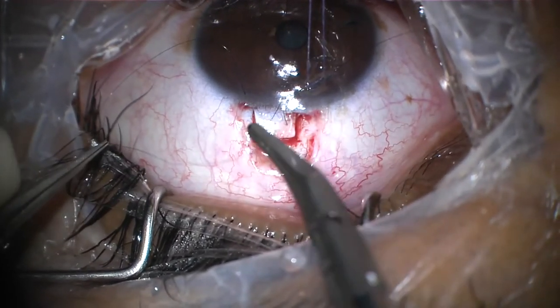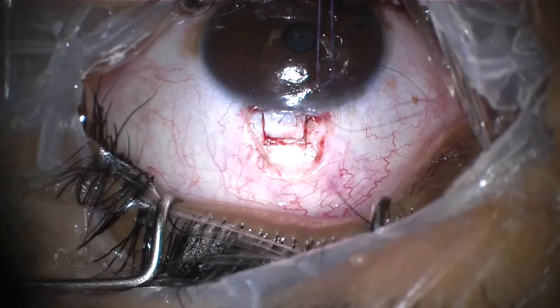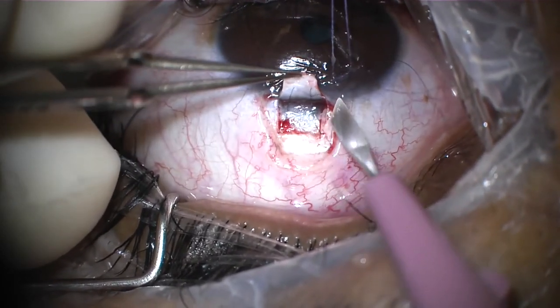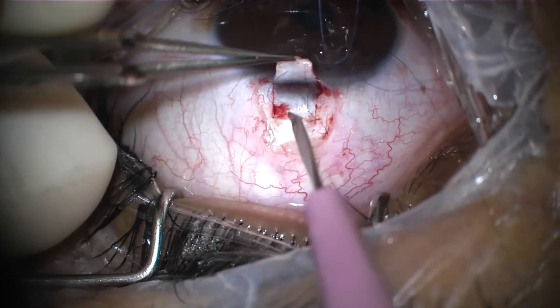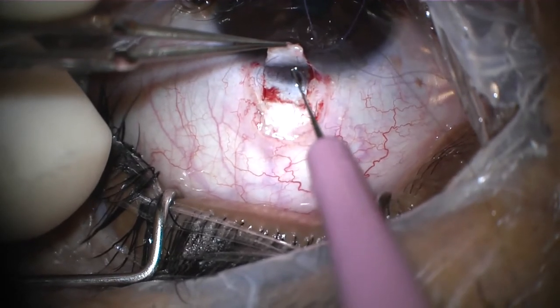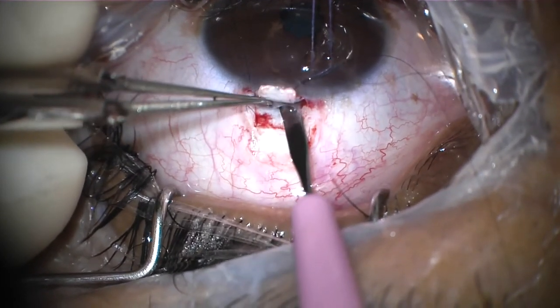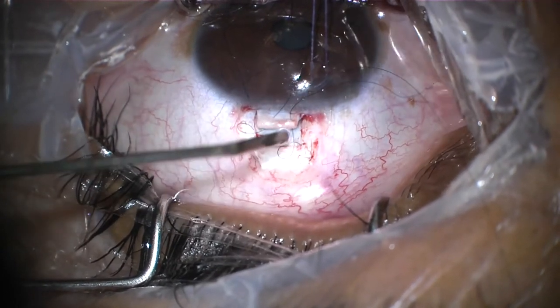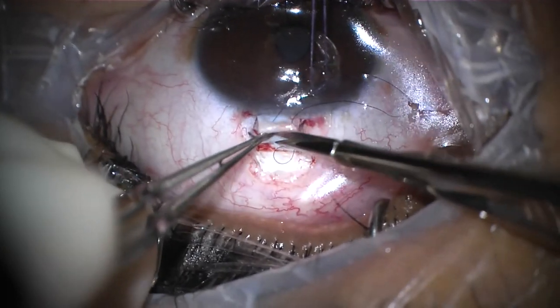The third pass is made in the cornea. Then, using the same blade to create a trabeculectomy window under the flap. Followed by performing a peripheral iridectomy.